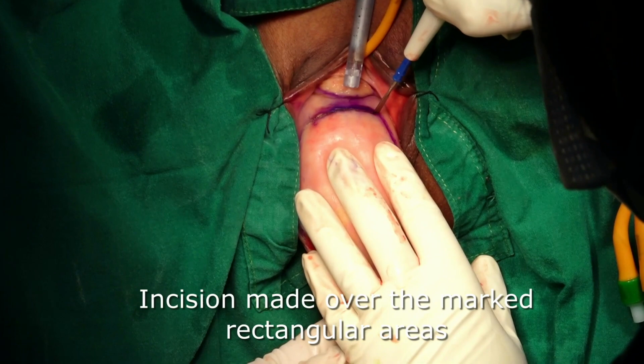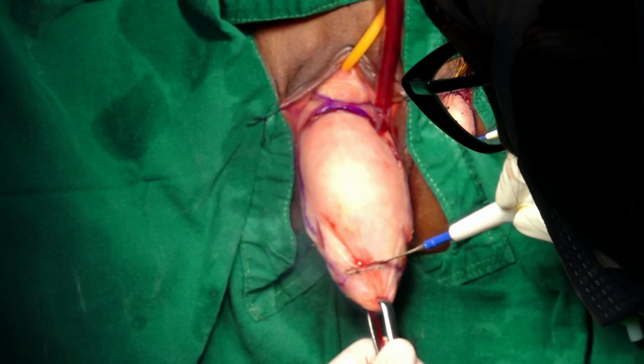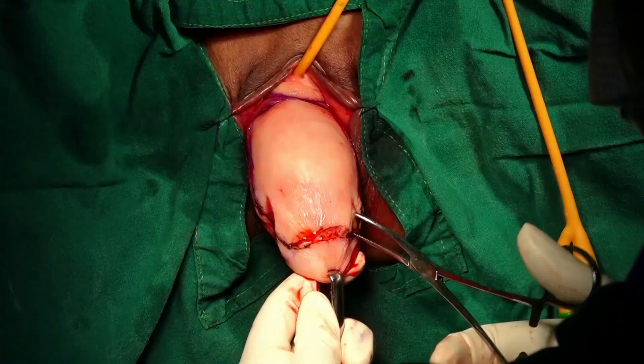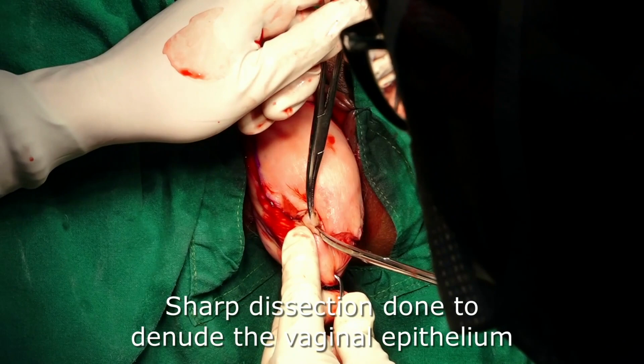An incision is made over the outlined area using the cautery. The outlines of the anterior and posterior rectangles create two lateral epithelial strips which serve as drainage tunnels. The edges of the raised flaps are held and sharp dissection is used to denude the outlined vaginal epithelial rectangles from the underlying fibromuscular connective tissue.